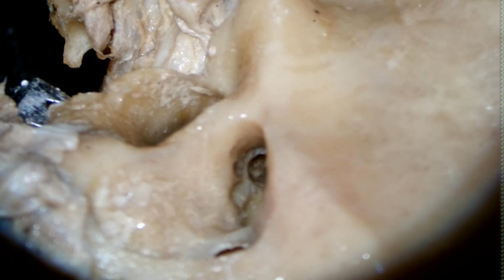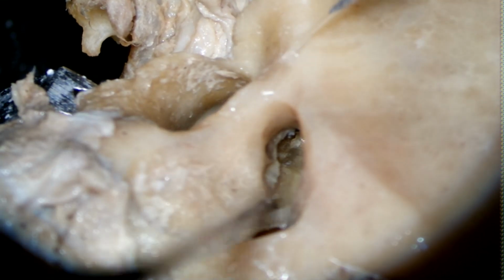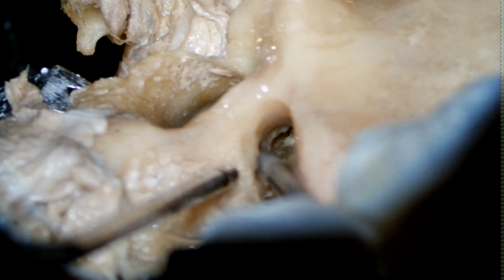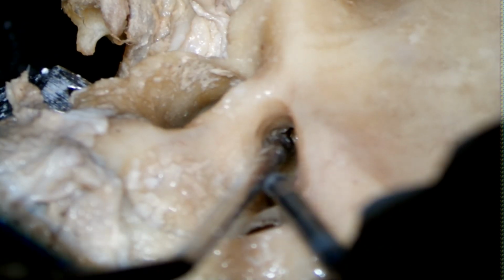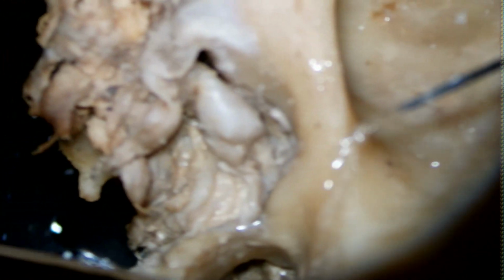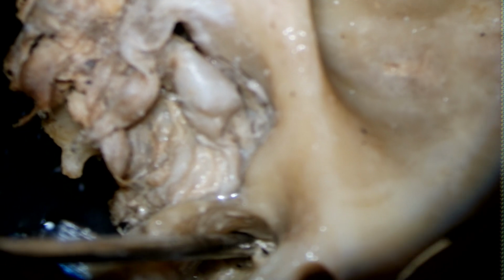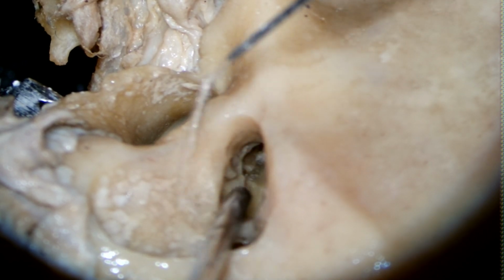Okay, so can you see this is the bulge of the lateral semicircular canal here, right? And just enlarge it slightly more. This is the incus here. So I can't see, I mean, there is no ossicle here. Otherwise, you would have seen the incus here, right?